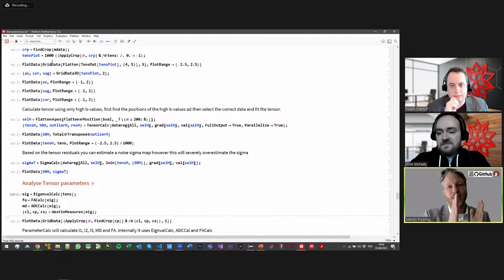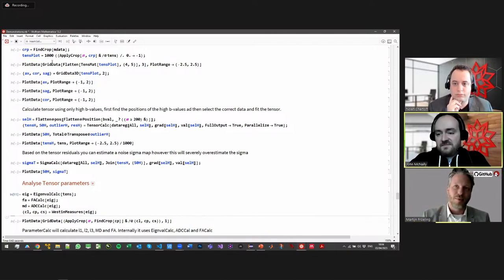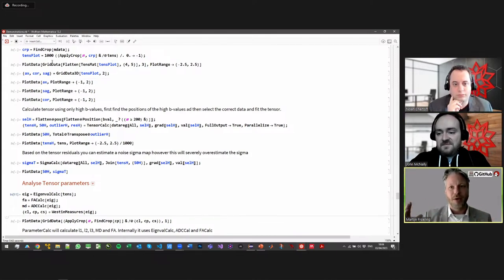All these steps are chunks, and together they form this big beast of a script that can do everything. But let's say I just want a slightly different denoising method. I can just swap out that one function, and really have a clear picture in your mind of which steps you have to go through. And if it becomes too big or too chunky, then cut it up into smaller projects that you can also debug more easily, so you can test these things in isolation.